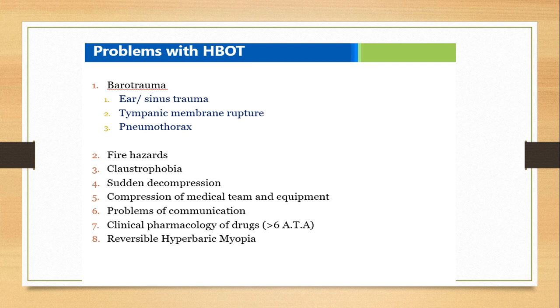With oxygen, there is always a risk of fire hazard. It can be claustrophobic. Sudden decompression can occur, leading to problems. There is a problem in communication.